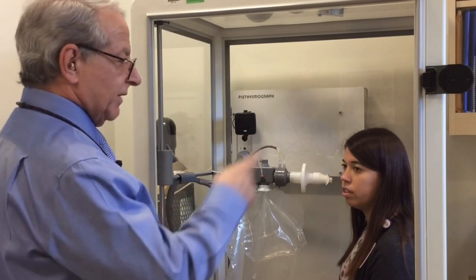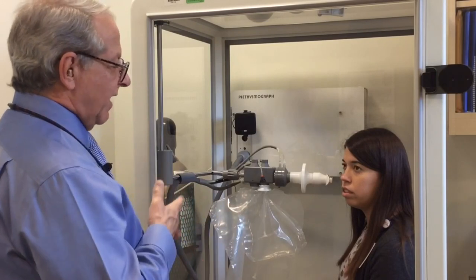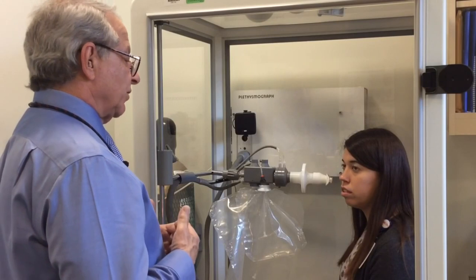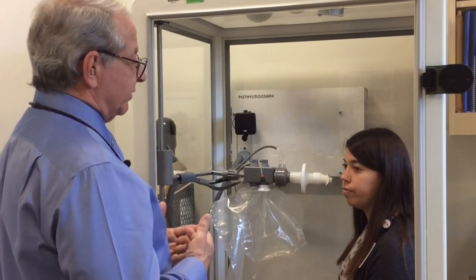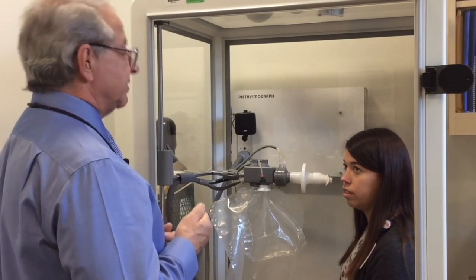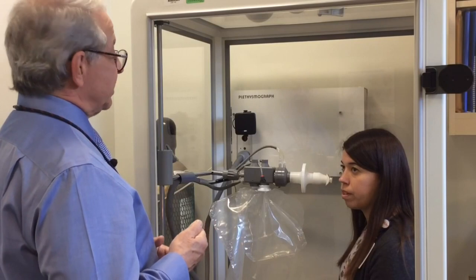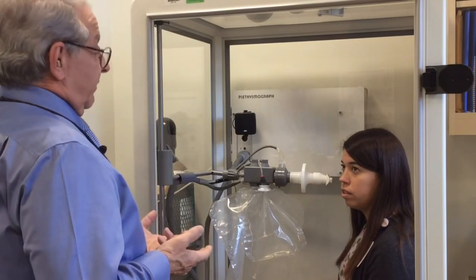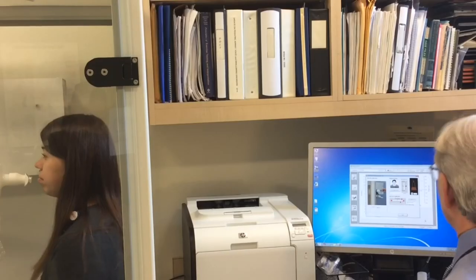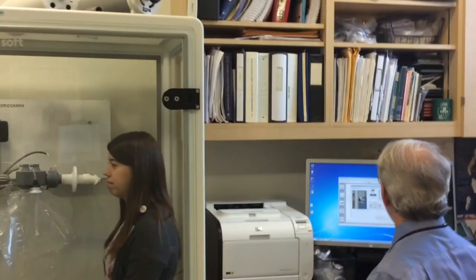And then once I settle on the box pressure, I'm going to hit the space bar. It's going to close the shutter valve inside the manifold, and we're actually going to measure her thoracic gas volume. So you'll take a few easy breaths, huff, huff, huff. You're going to feel some resistance. Just keep huffing up against that closed shutter, and at the end I'll say to you, take a slow, deep breath all the way in, full chest, let it all out, and a breath back in again. Okay, so we're just going to wait 30 seconds, Danielle, for that pressure and temperature to settle inside the box.